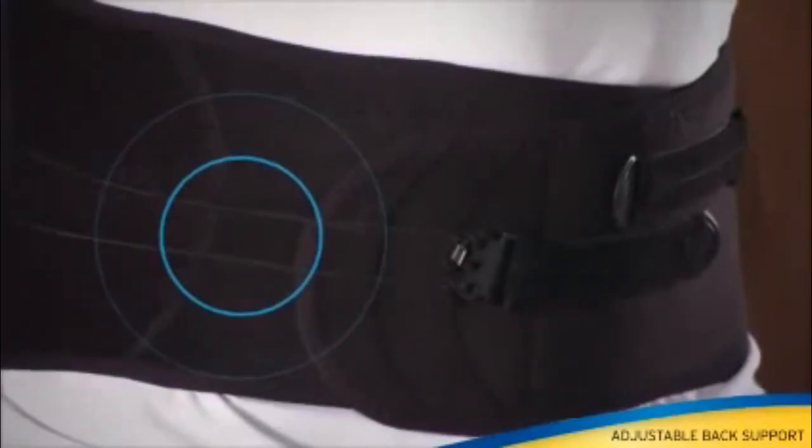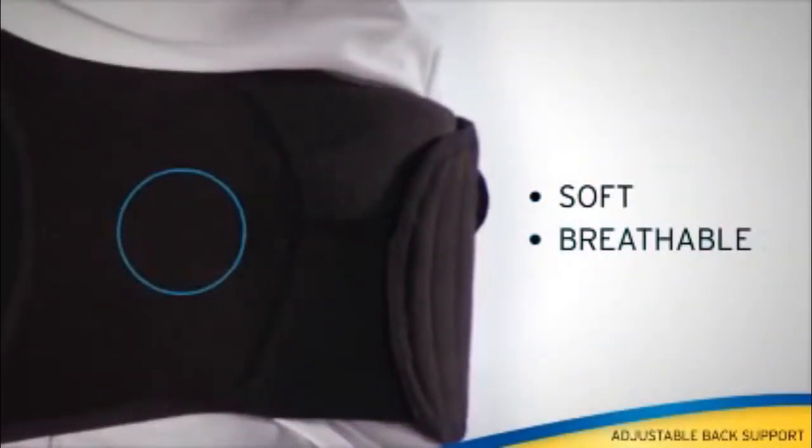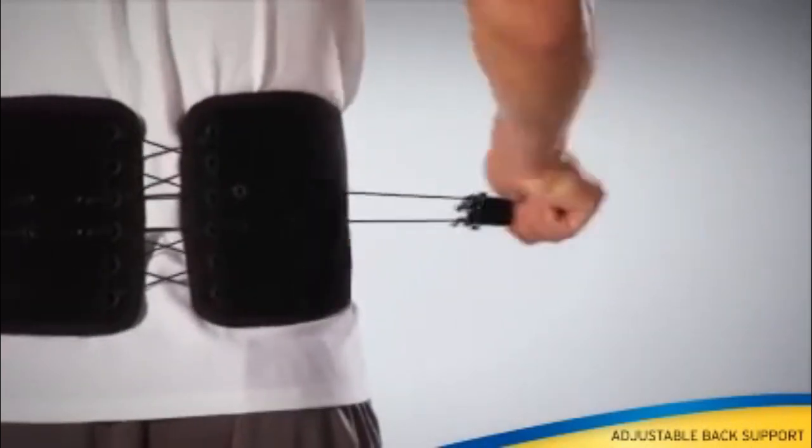Side stretch panels help minimize slipping and bunching. Soft breathable materials. Durable lacing for all day wear.